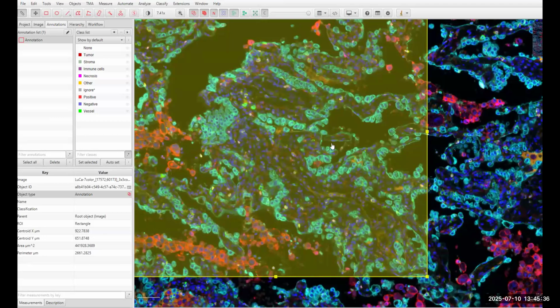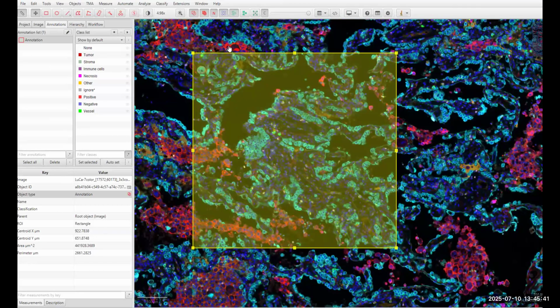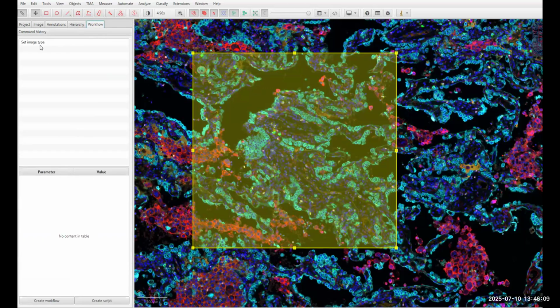Workflow. Now, often when I'm doing image analysis, at least, I have to try a whole bunch of different filters, a whole bunch of different processes in order to get the image prepared before I do my analysis. Often this involves doing filters and things like that, and trying to extract features. Now, trying to keep track of that can be very exhausting. So what they do have is a workflow indicator.